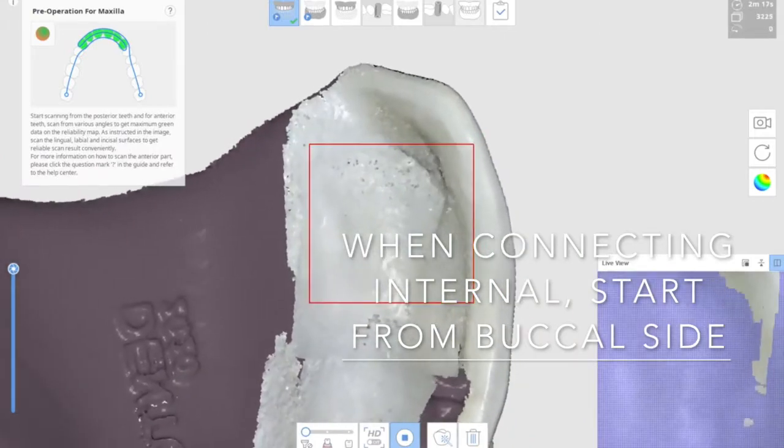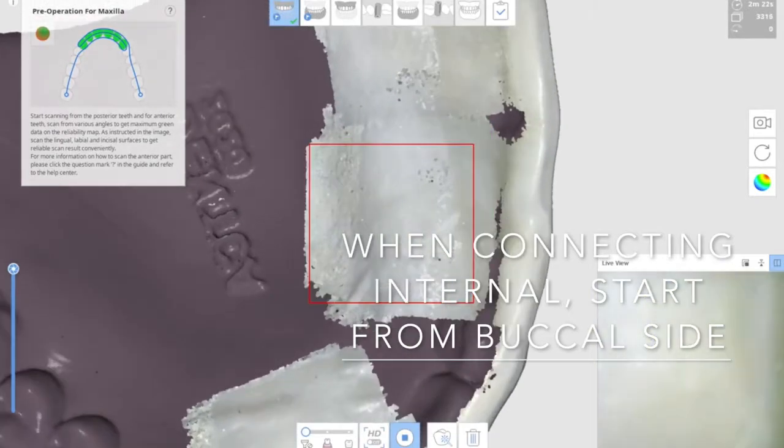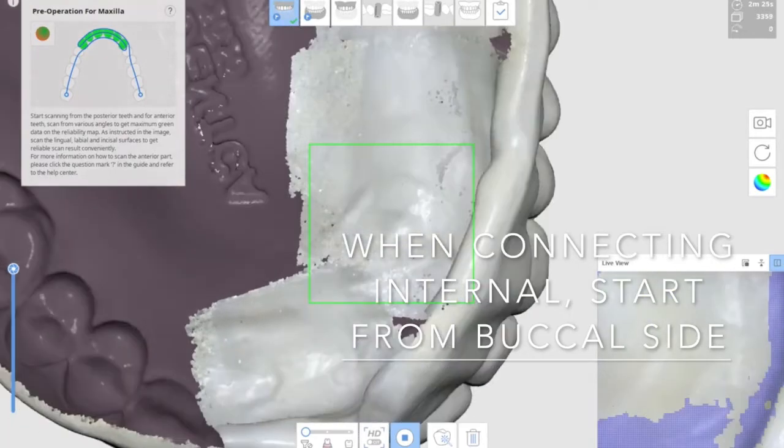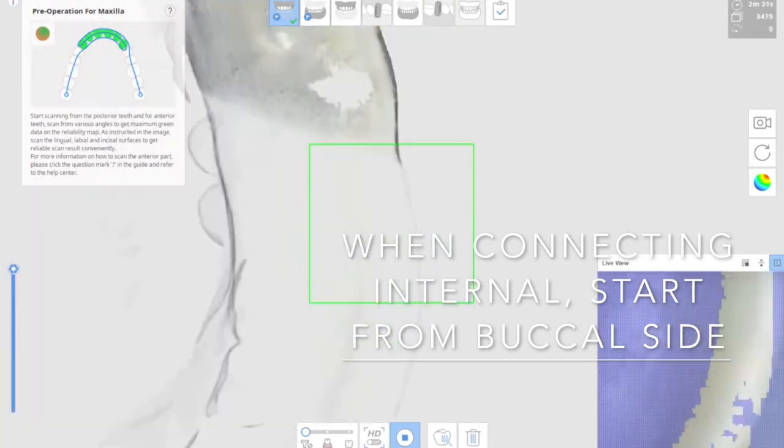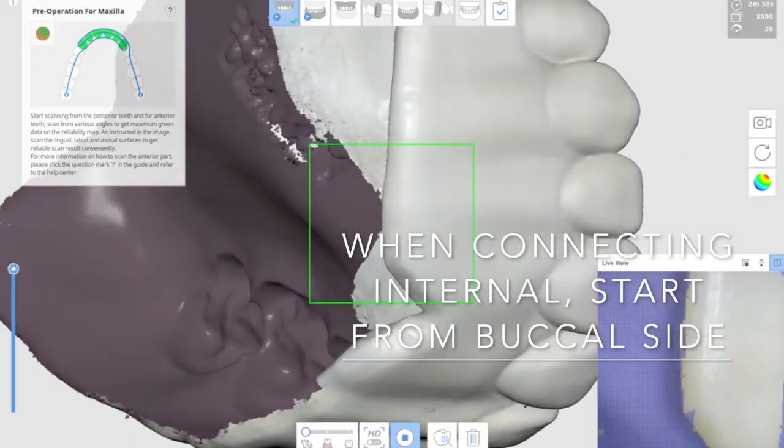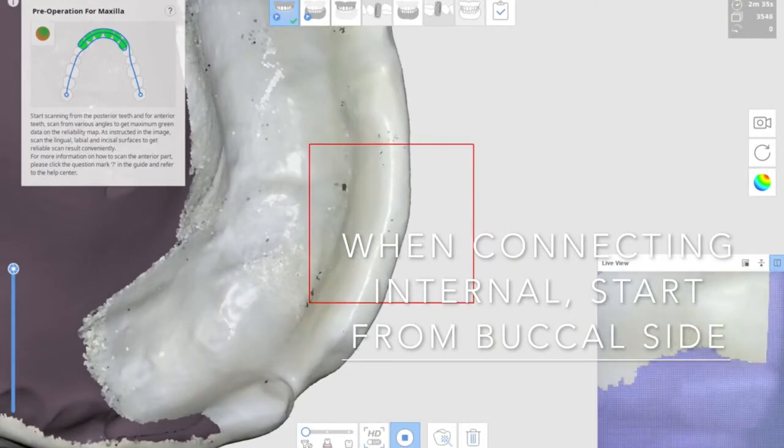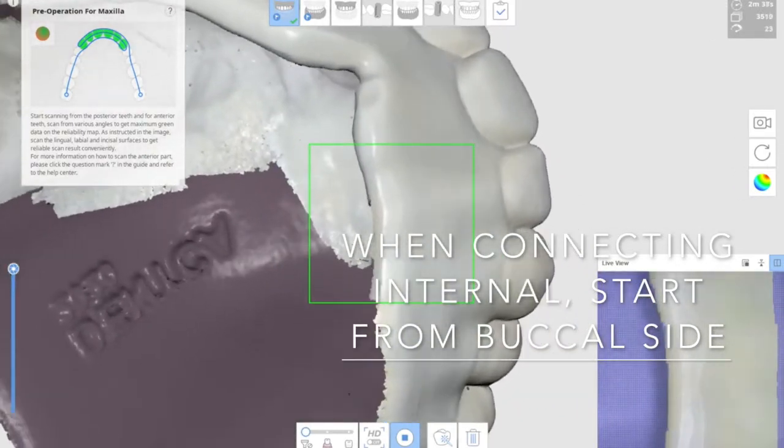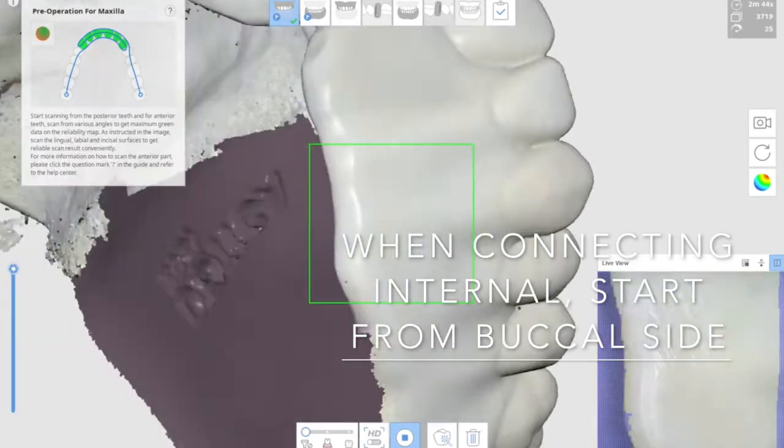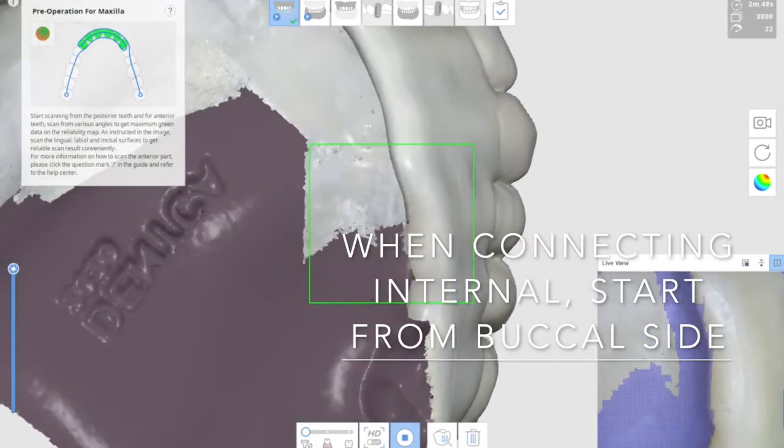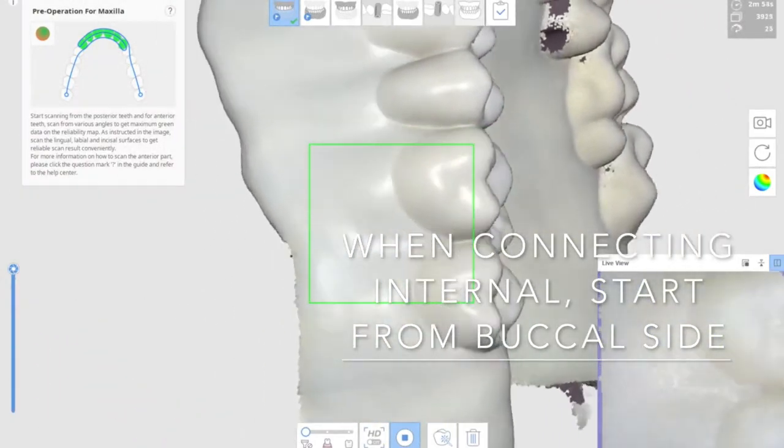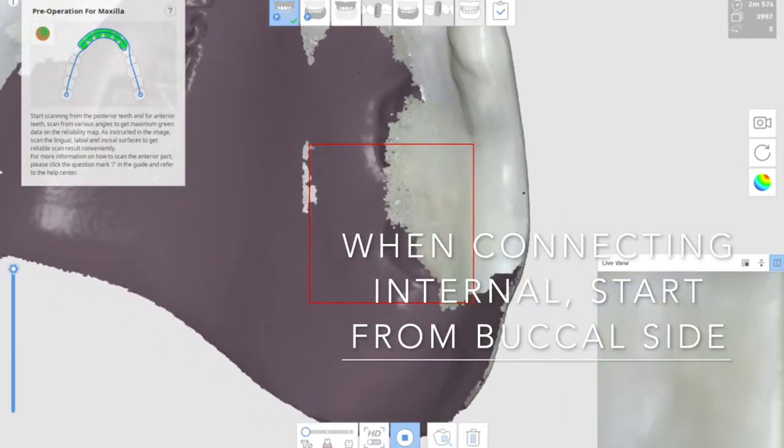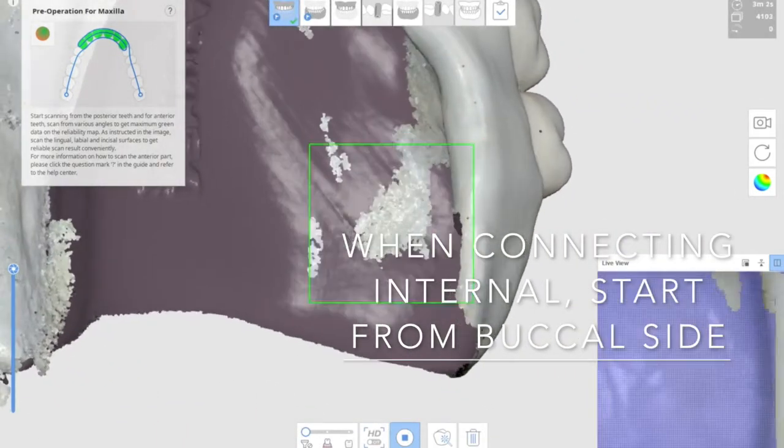Scanning from the buccal, rotating it, and initial cover on the internal surface. When you scan internal, if you just scan the internal surface, you will have some error mismatching around the border. To avoid that one, you are starting from the buccal side and then rotating into the internal surface. I'm continuing doing the same motion: start from the teeth, go around the border, rotating it to show the internal surface, all the way to the entire arch.